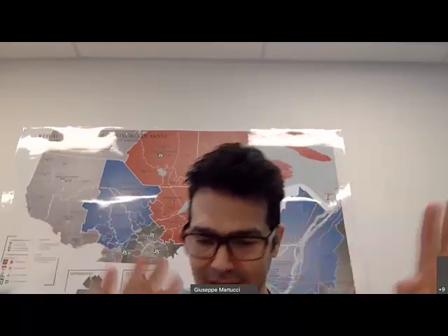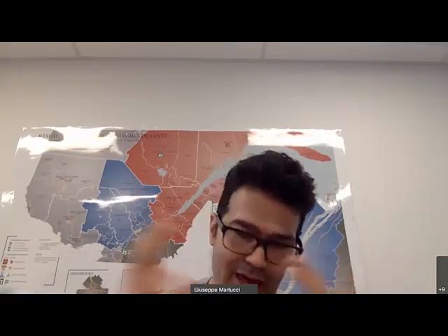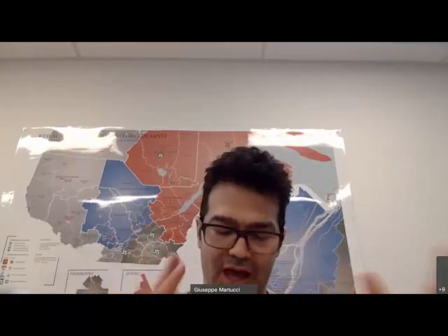But I want to emphasize that if you really understand the relationship between what you see fluoroscopically, what the CT scan tells you, and what the echo images tell you, and if you could really integrate in your head those three imaging modalities, I think you can go a long way without necessarily always needing 3D. I think 3D printing and modeling is exceptional. I think it's fantastic. We've done it a few times. But once you start to understand the relationship, you can use it in very selected cases.